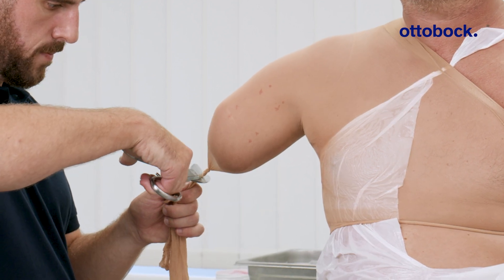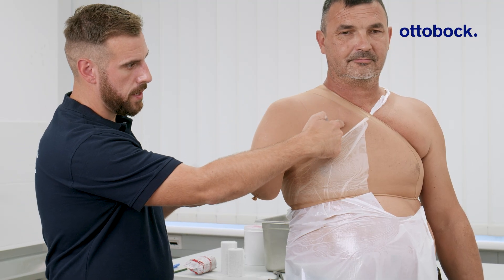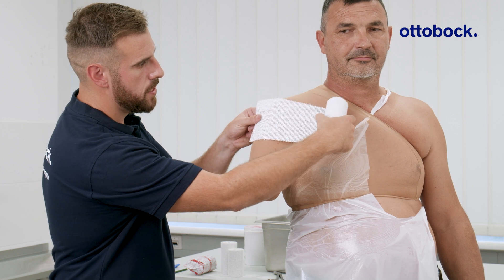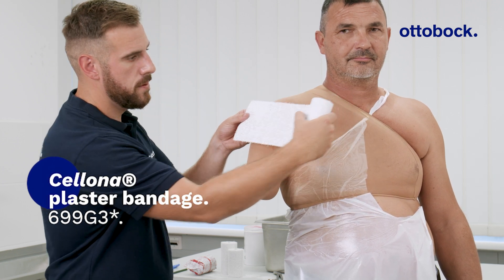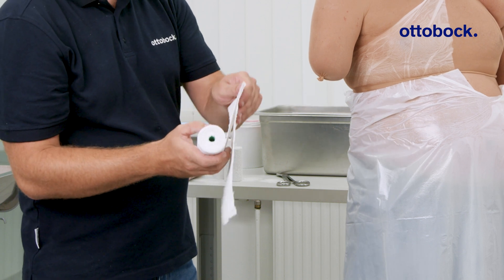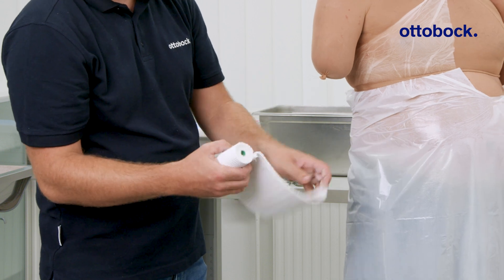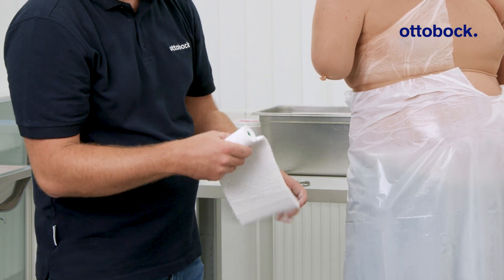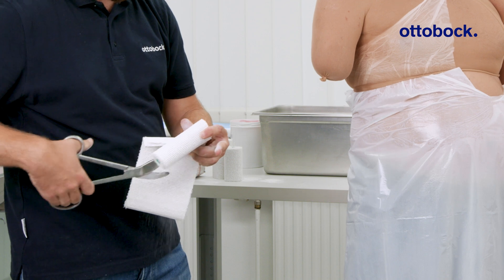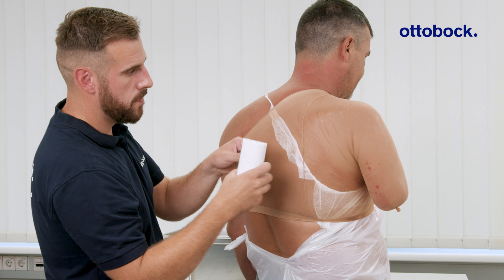Prepare two non-elastic plaster bandages. The anterior splint should extend from the lateral center of the residual limb to just below the clavicle. Each splint should be approximately seven layers thick. The posterior splint should extend from just below the spine of the scapula to the lateral center of the residual limb.